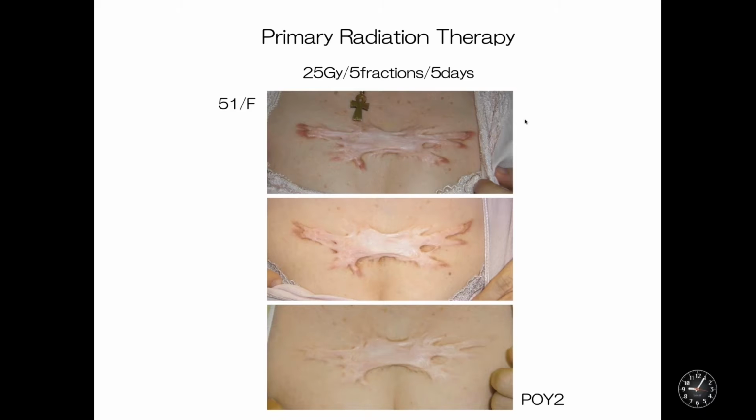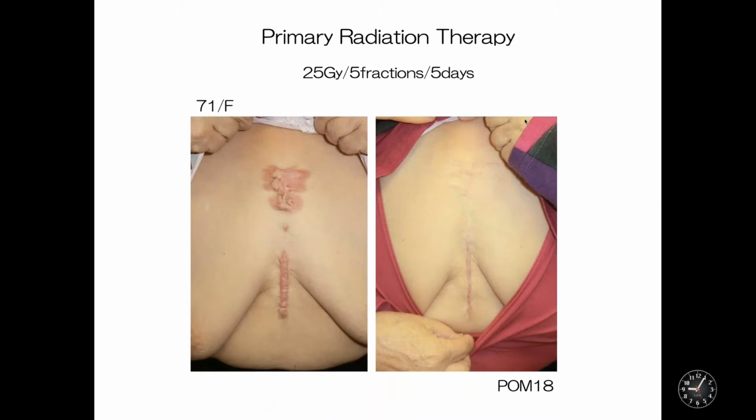This is also the peripheral area. In the high tension area, inflammation is strong, so it was treated by radiotherapy. Just the peripheral area. This is another case.